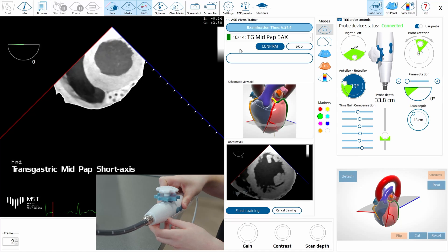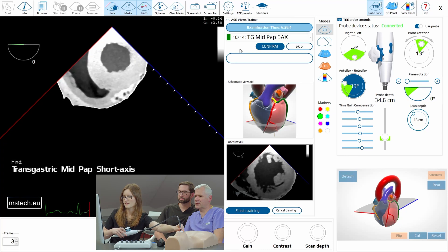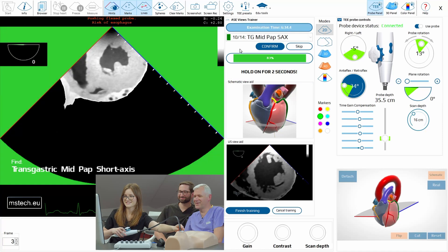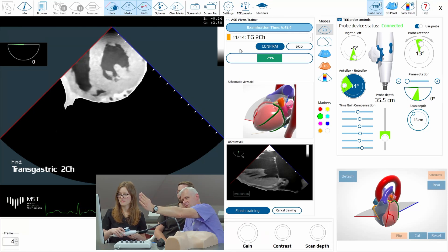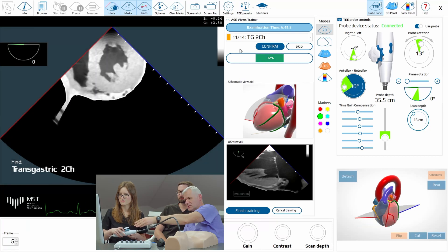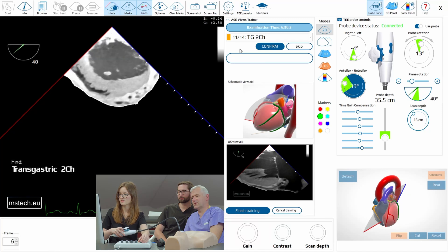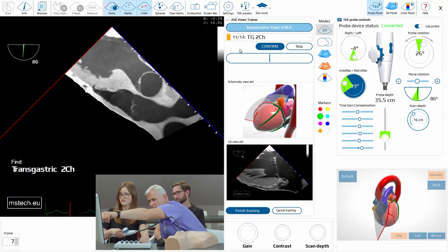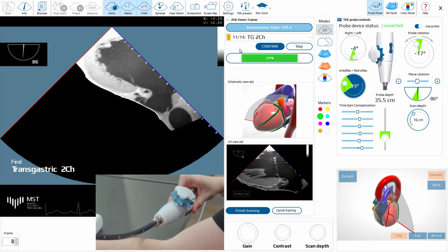Now the mid papillary short axis, so you have to go slightly deeper. You perforated — that's nothing. Okay, short axis. Good. Two chamber. So you see the short axis and we have to see the perpendicular view. Keep it as it was and change the angle by 90 degrees. Perfect. But here you see there's an issue — you are too much towards the right, so you have to rotate left. This is the two-chamber view.